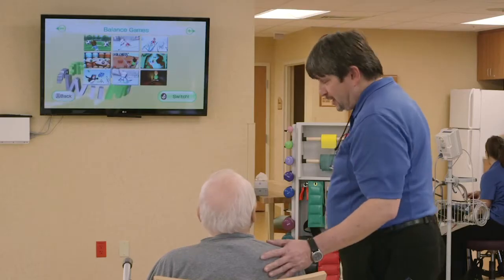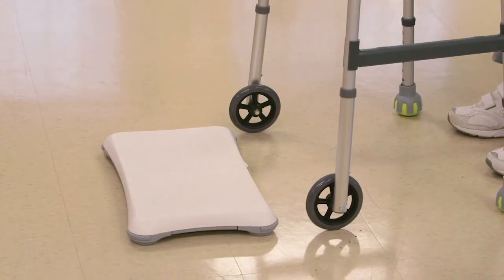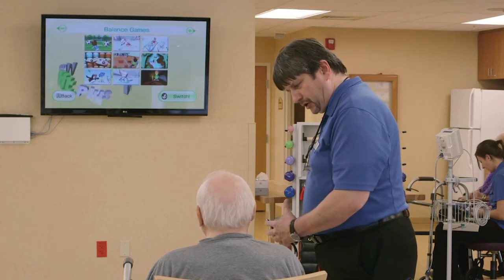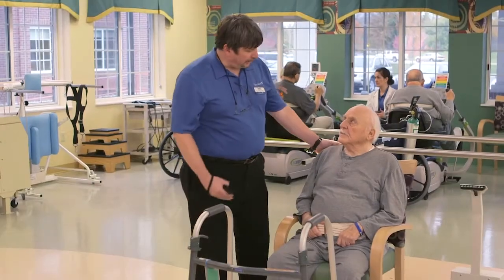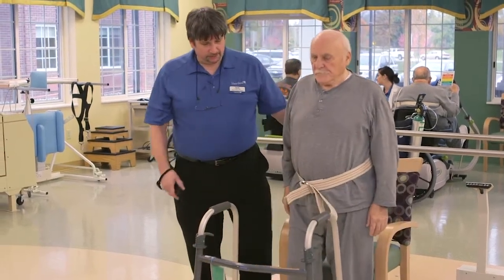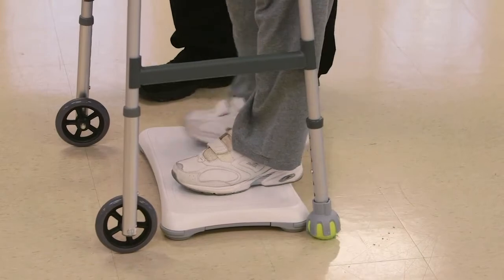John, we're going to be doing the Wii system today. The Wii Fit has that balance board right there, so it's going to have some sensors in there. It's going to know where you are and how you're positioning yourself. Now we're going to play the game, so what I want you to do is stand up, take a couple of steps forward, and step onto the board.